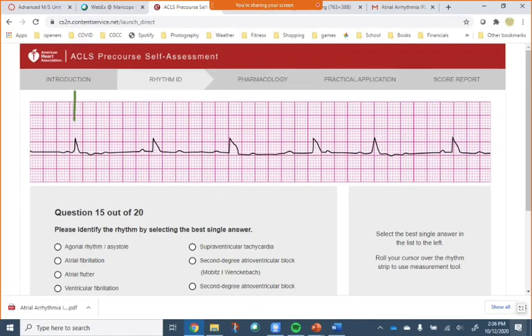And what we do is we check, is this regular? And you would see if you measured these. Yes, that's pretty regular. And then we check our P to P intervals the same. So now we start looking at anything that's suspiciously a P. And we see that we could march this out. That these P's are completely disassociated. Those are all P waves. And we know that we either have to call it a first or a third because there's no drop beats. And this one wins third.